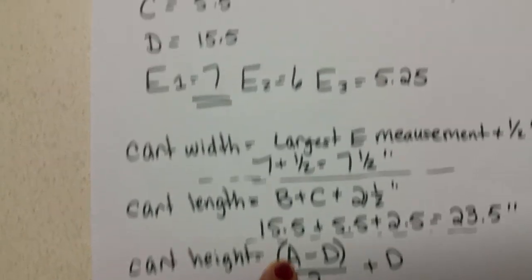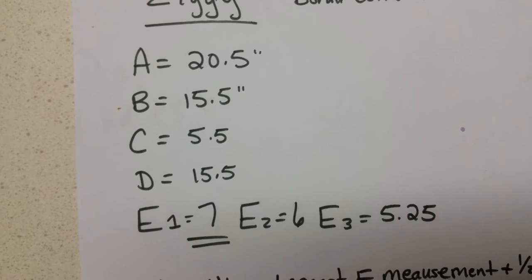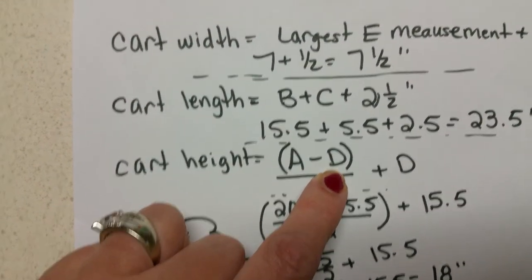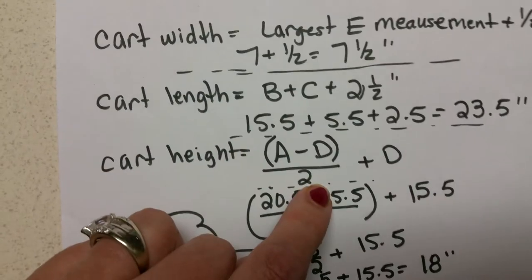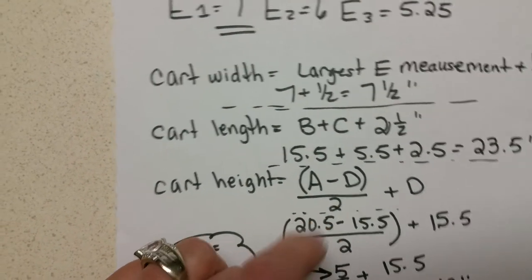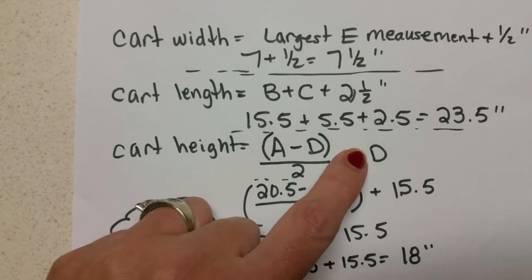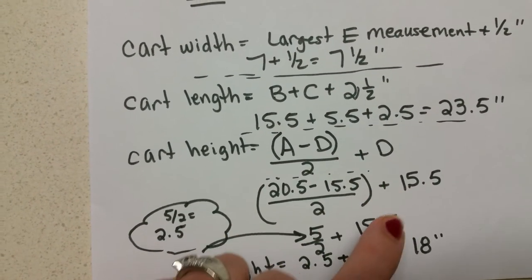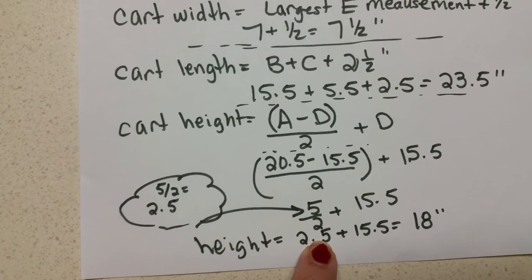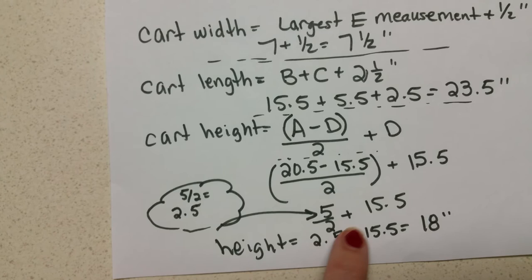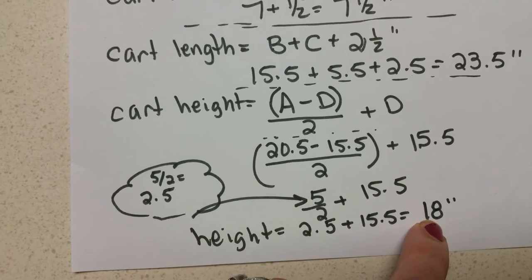To figure out the cart height we take A, which was the height from the dog from the ground to the shoulders. We subtract D, which was the groin height, the height from the ground to between the dog's legs. We find out that difference which happens to be five. Then we're going to divide that by two. And then we add that back onto D which was fifteen and a half. So the height, two goes into five two and a half times. So two and a half plus the groin height equals eighteen inches. So this cart is going to be eighteen inches tall.